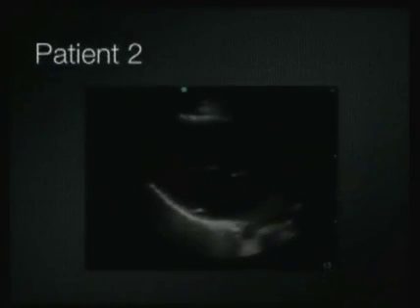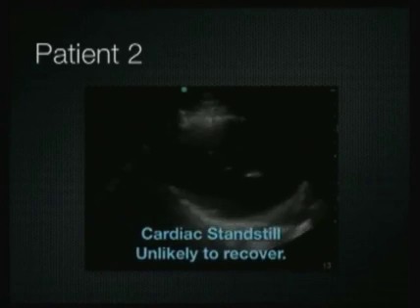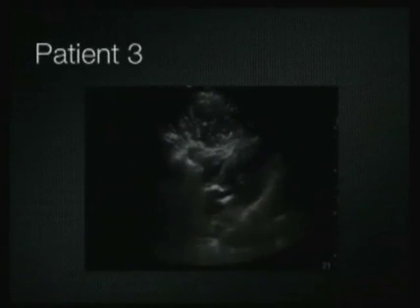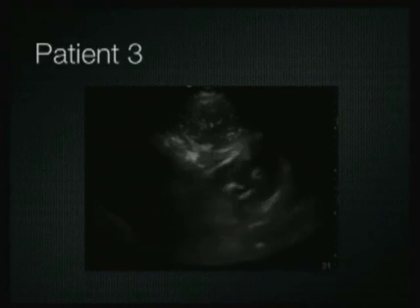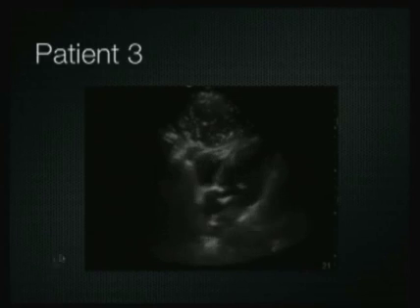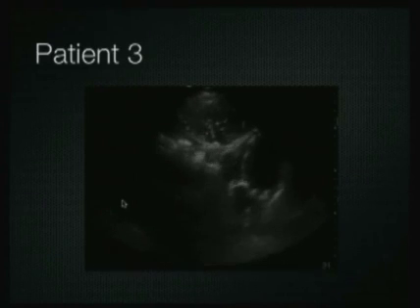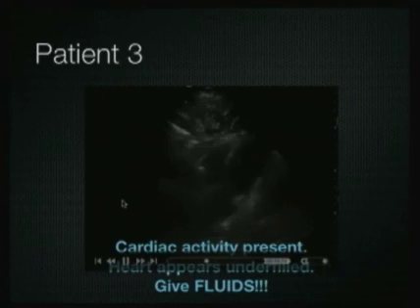In our second patient, again, we see cardiac standstill. The patient is probably not going to recover here. In the third patient, we do actually see some mild contraction pattern. A little bit is hypokinetic, but there is something there. And if we also notice, we can see that that RV is fairly small, suggesting the patient's underfilled. So in this case, I would continue ACLS and even give more fluids if I haven't been giving them already, as the patient looks slightly hypovolemic.